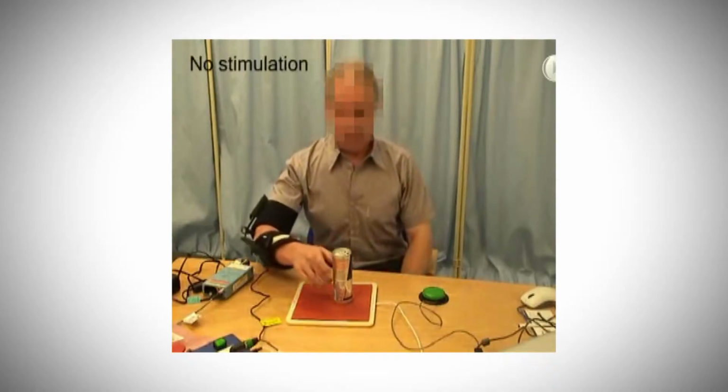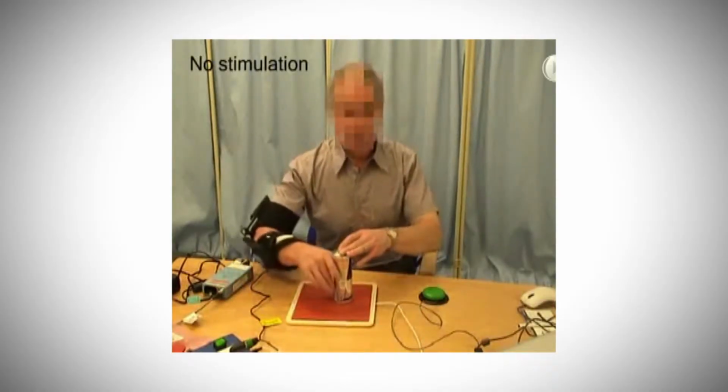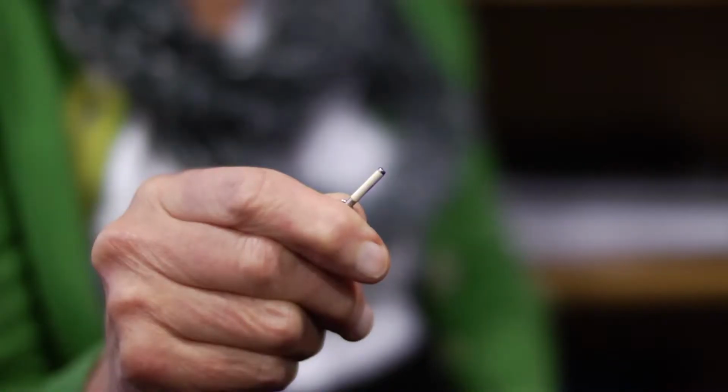After a few years, other people heard of what we were doing, and they suggested that maybe we could do something with the problem that people have with their hands. We were contacted by a not-for-profit organisation in California called the Alfred Mann Foundation, and they were interested in working with us because they had a little stimulator like this, which is very small, and this can be injected under the skin to lie next to one of the nerves going to one of the muscles that moves the hand, or that moves the elbow, or that moves the shoulder.